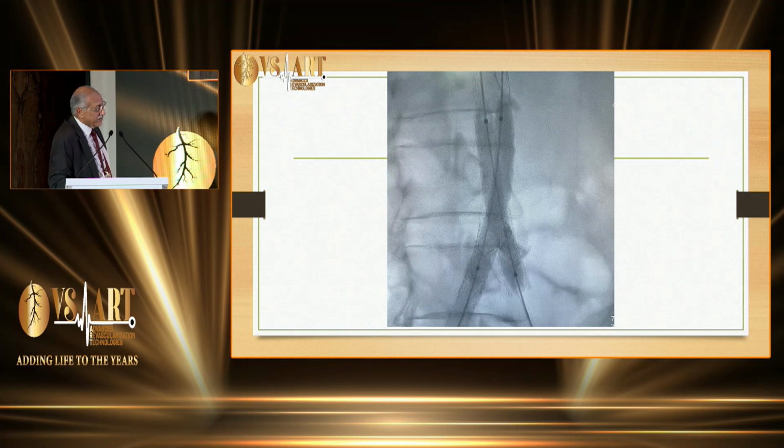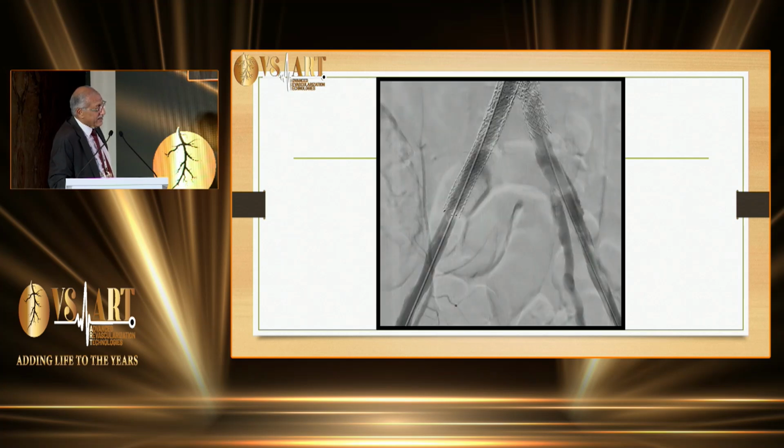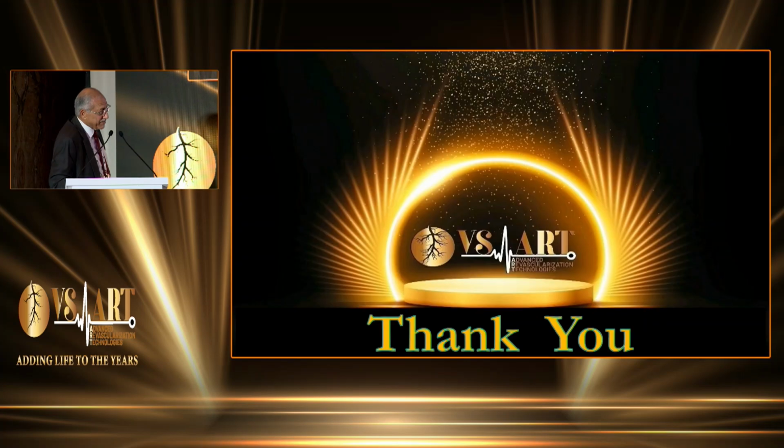And this is after inflation of the stents, and this is the final result. Thank you very much.